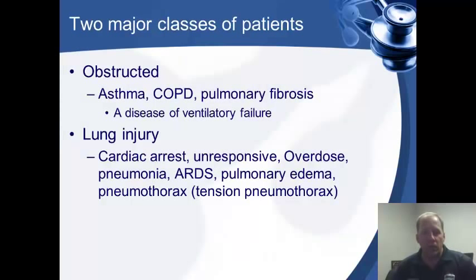I want to divide your patients into two major classes just for simplicity's sake and to make it easier for you to decide on settings and to quickly and effectively ventilate your patient without much delay. I want to put them into two categories, and these two categories are obstructed and lung injury patients.